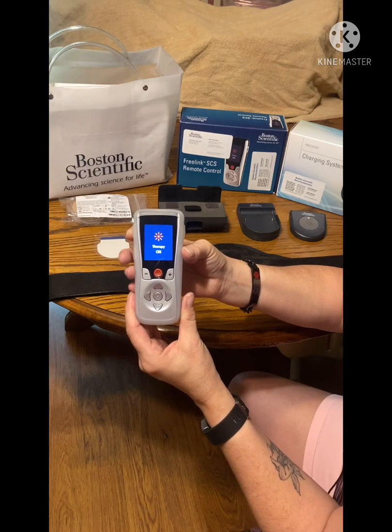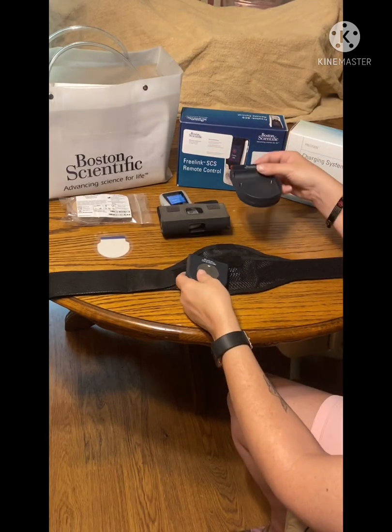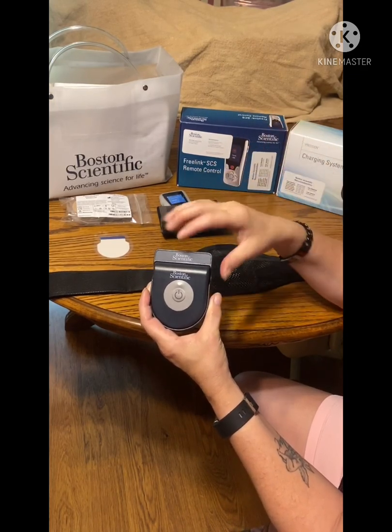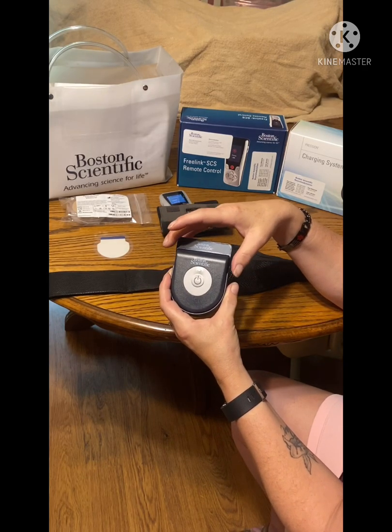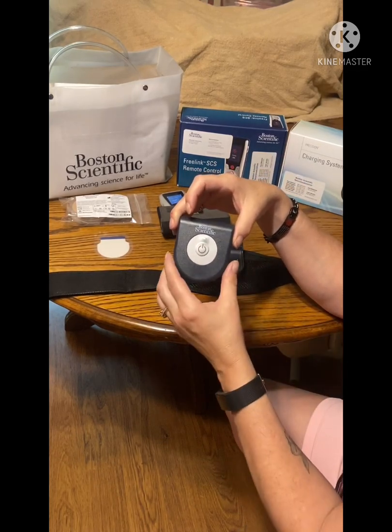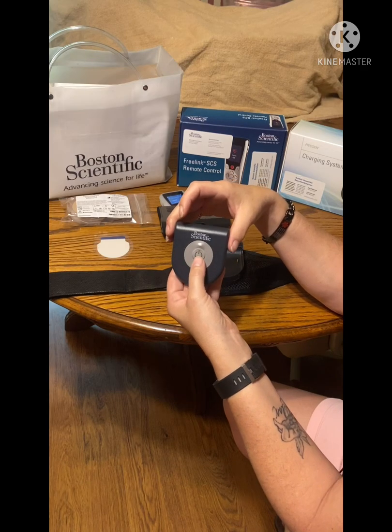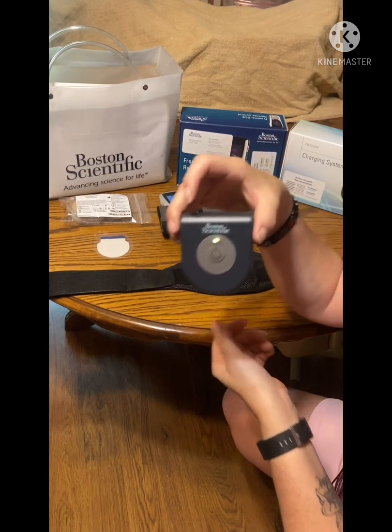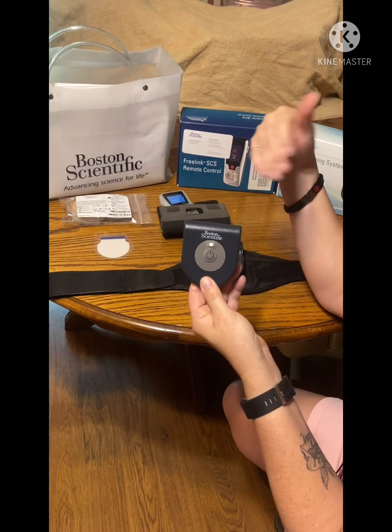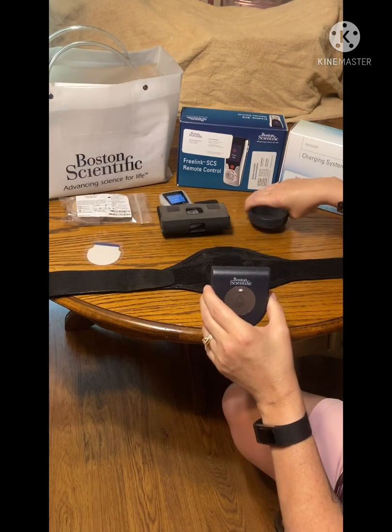It now says therapy is back on. Now to charge the system that's in your back, or wherever you have it implanted, this is where you charge — the puck just sits in there, has a cord that's plugged into your wall. This light will turn on when you're ready to charge yourself. When you're getting ready to charge it, it's gonna make that beeping sound until it finds where you're supposed to go. Once it finds the generator, it'll stop beeping.